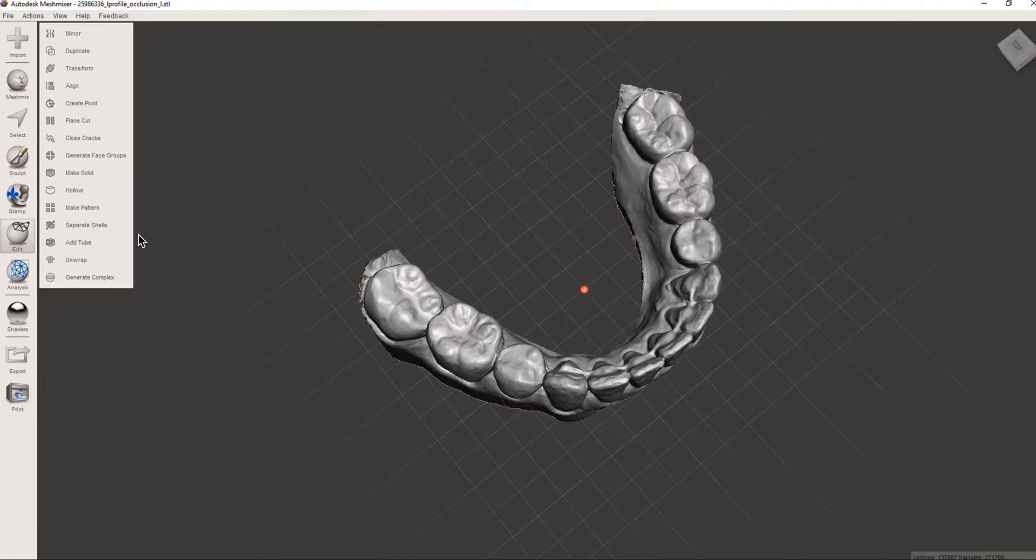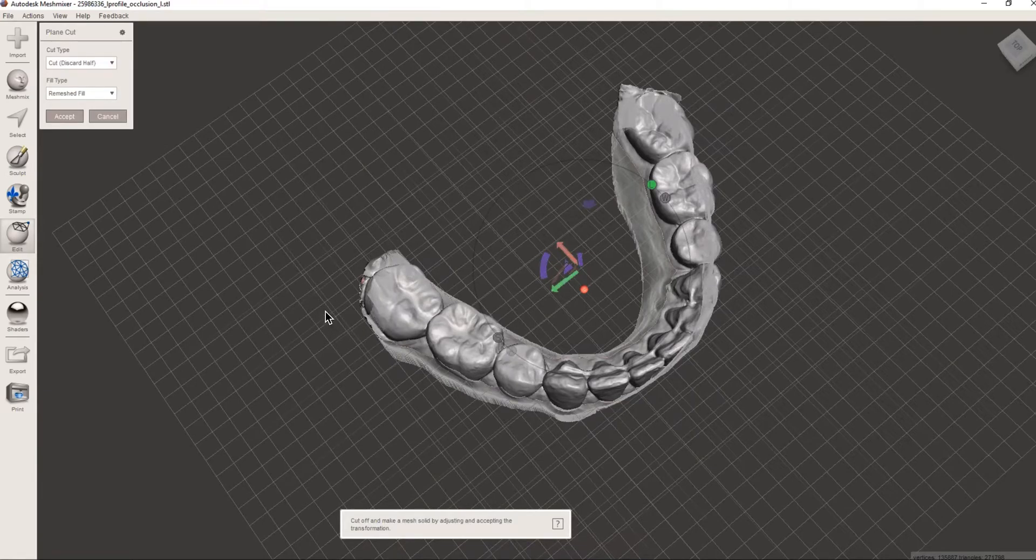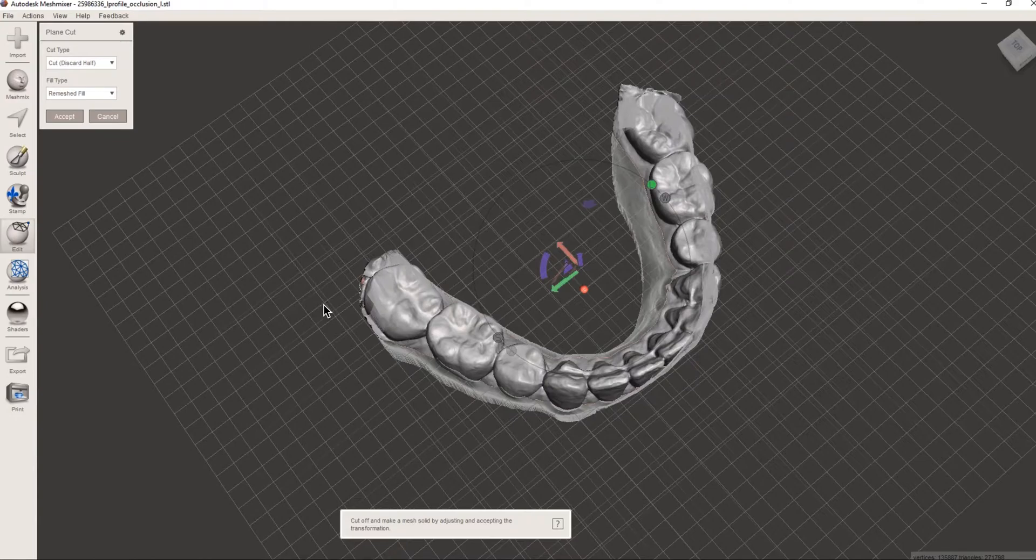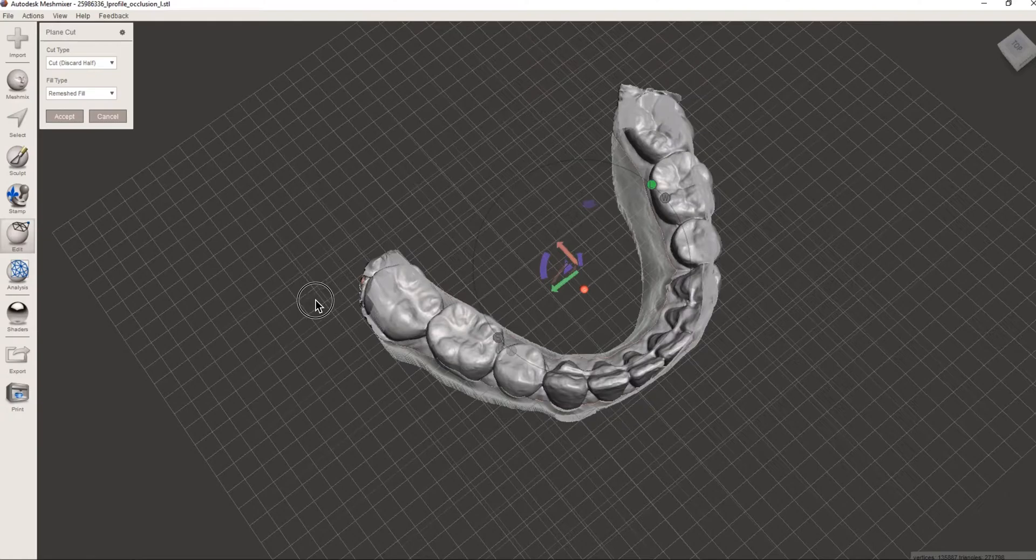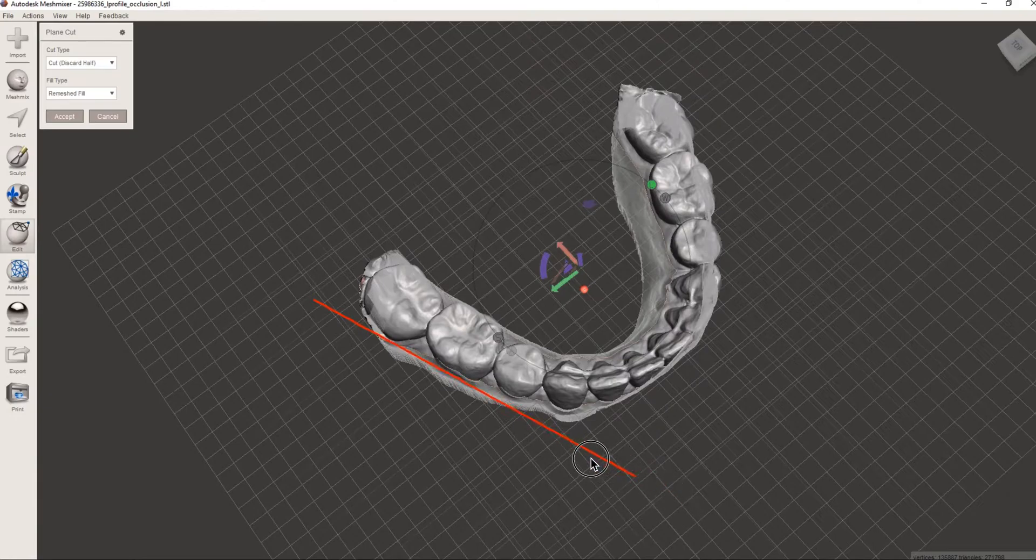So first tool we're going to use is the plane cut. We'll go to edit, plane cut. Now this is basically like a knife that we're going to use as our digital model trimmer. So what we do is we'll left-click any point on the print bed that you see here, drag it over and wherever we stop that line we can change the angle.